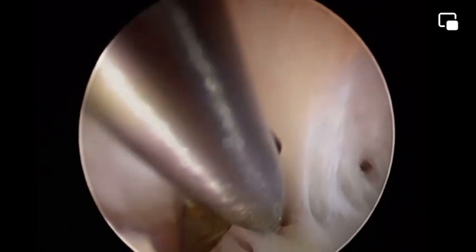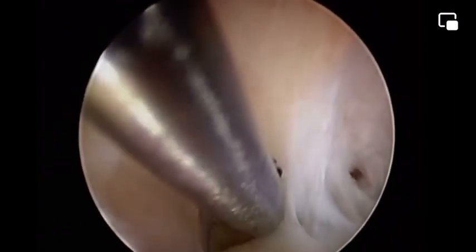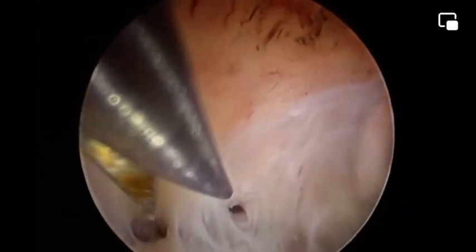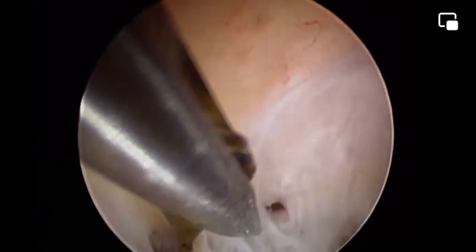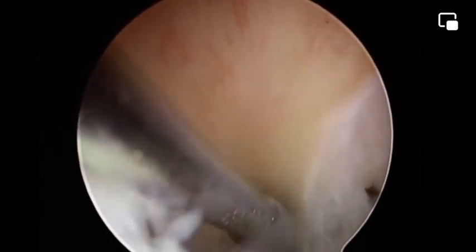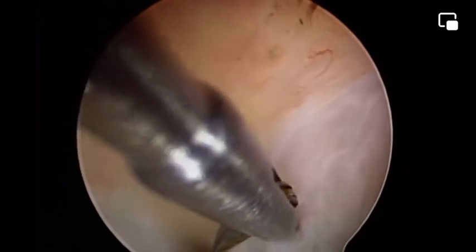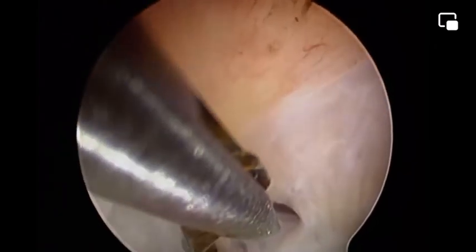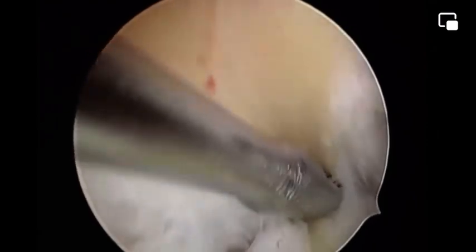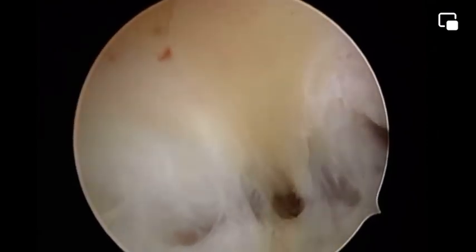Meanwhile, the orifice on the side, which I diagnosed as a tubal ostium, could not be the tubal ostium. There could still be access to a deeper space. So how to know? It is difficult to go in with the telescope in this narrow opening. So just push the scissors through this opening like I'm doing here, and this will help you to know how deep is the way or the recess. Same like a blind man using the stick to know the road, okay? So follow the scissor procedure. I'm coming back with more and more tips.